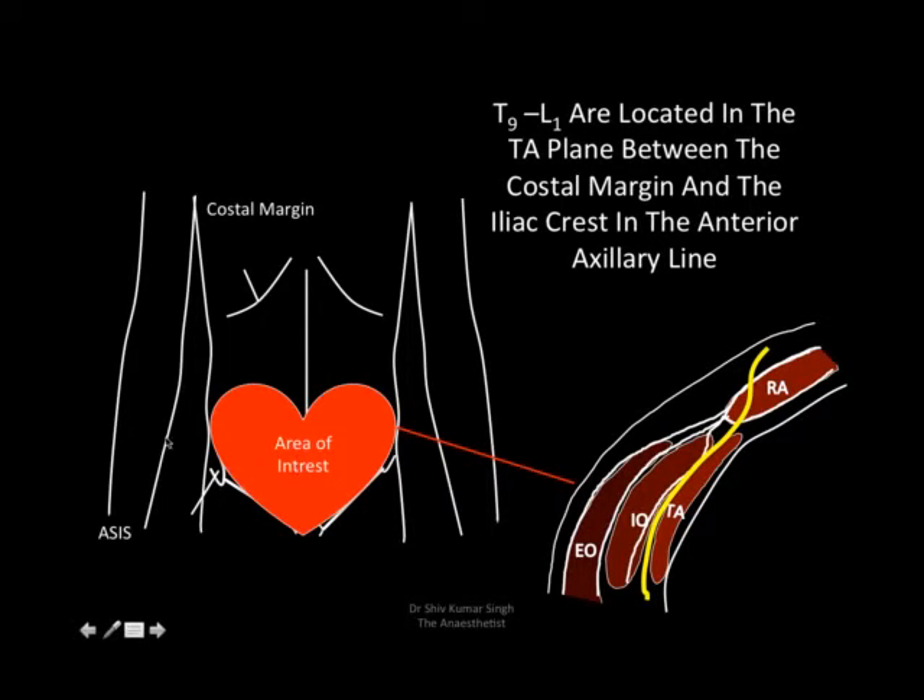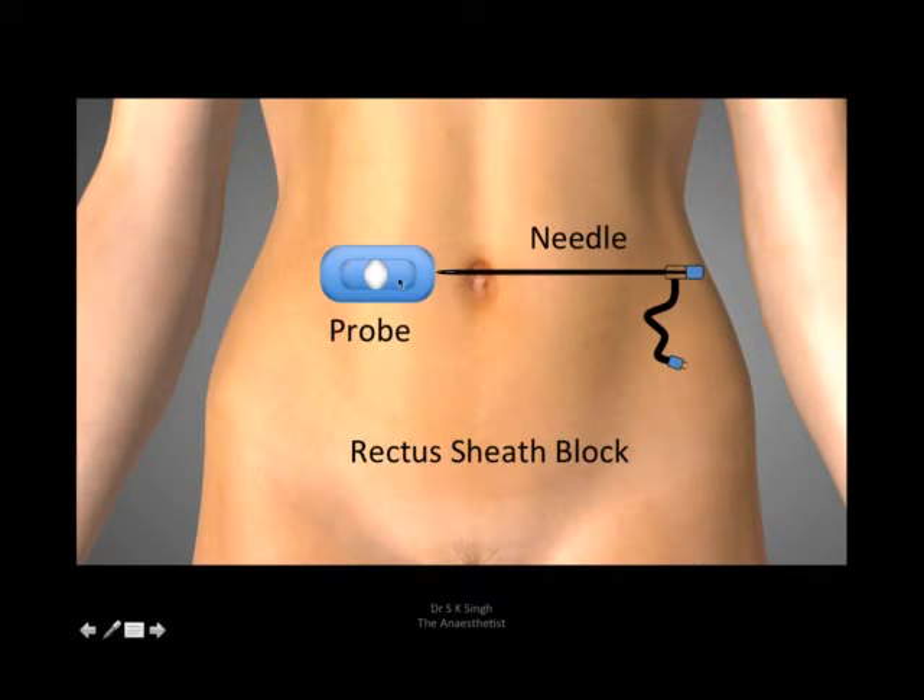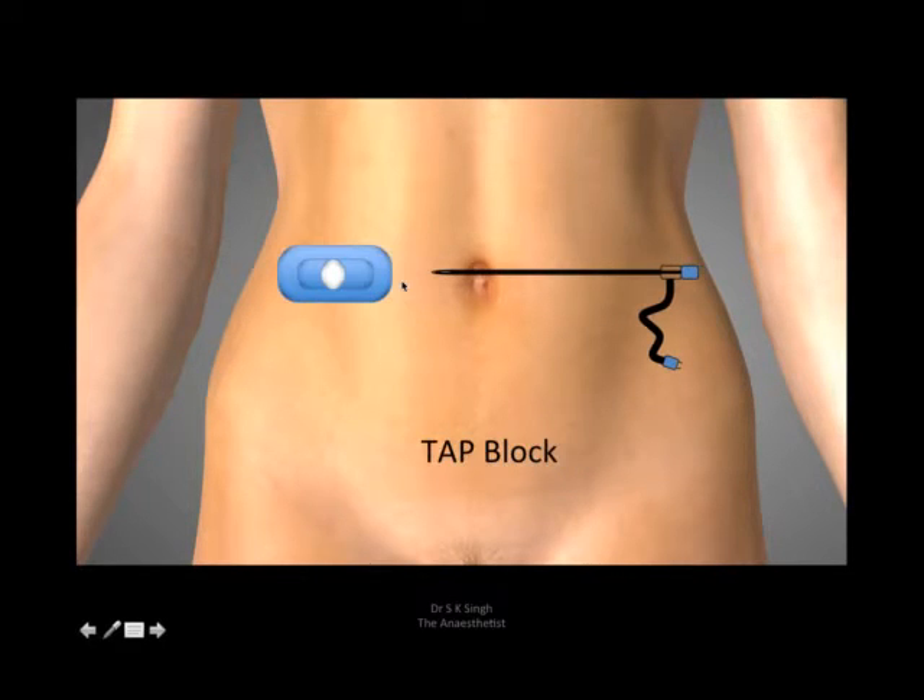That's basically the area of interest for us. The probe is placed a little lateral to the umbilicus, just over the anterior rectus sheath and the lateral border of the rectus sheath. The needle comes from medial to lateral for the rectus sheath block. Then we move the probe a little more lateral, just over the anterior superior iliac spine, and the needle goes a longer distance into the TAP plane.